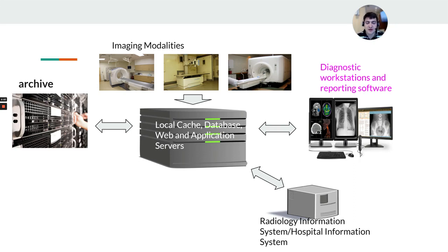Now, they're going to create the report usually in dictation software, and actually there should be an arrow between the dictation software and the RIS as well, because that's ultimately where we're going to send the report, and then that report is going to come back and live on PACS as well.